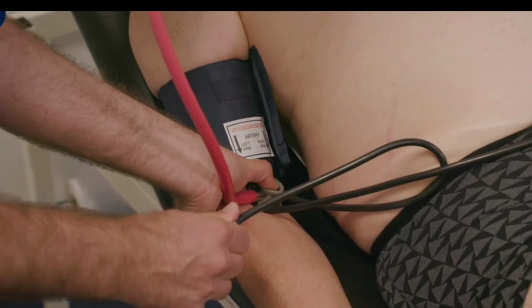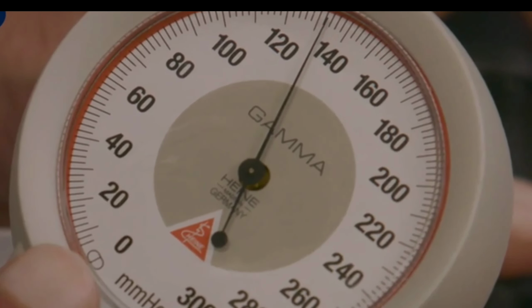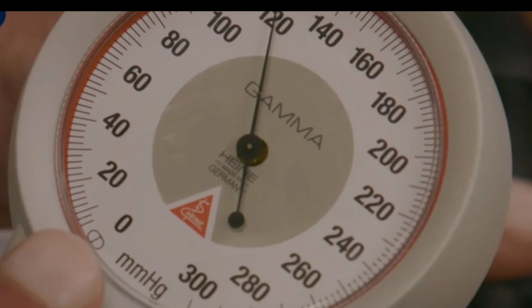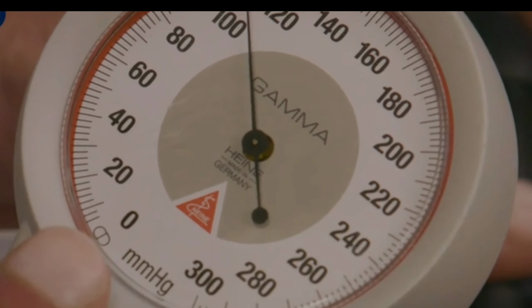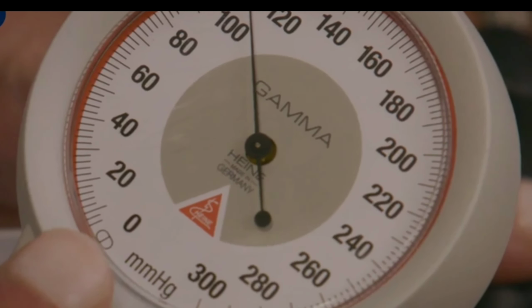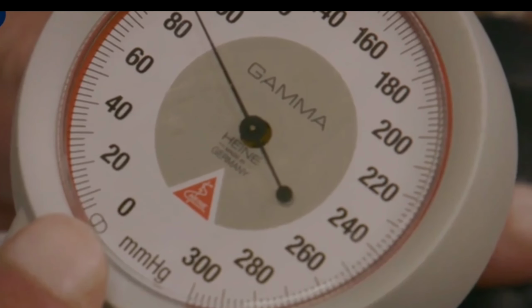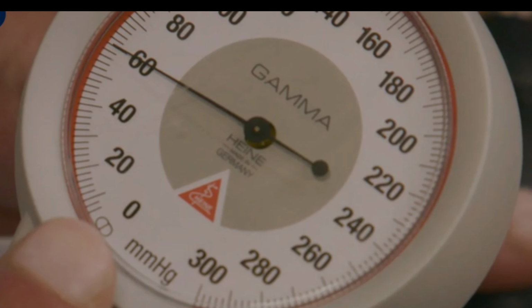The cuff is then slowly deflated, listening for the onset of the first Korotkoff sound. This reading is taken as the systolic blood pressure. The examiner continues to release the blood pressure cuff until the pulsatile sounds completely disappear. The final sound heard, signifying the transition from the fourth to the fifth Korotkoff sound, is taken as the diastolic blood pressure.